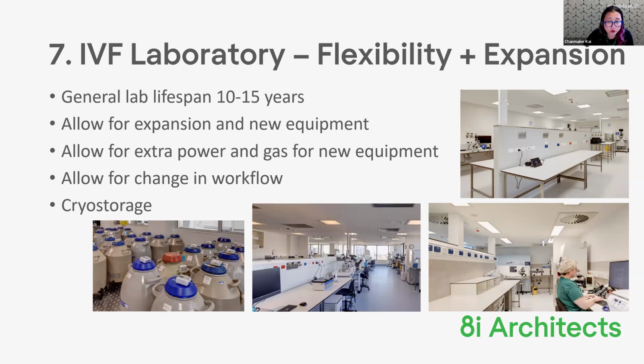A change in workflow is something to allow for, and you can see in all my labs, the benches can move around. So we can move those benches to either remove them or shift them to a different location so that we can put in different types of equipment.